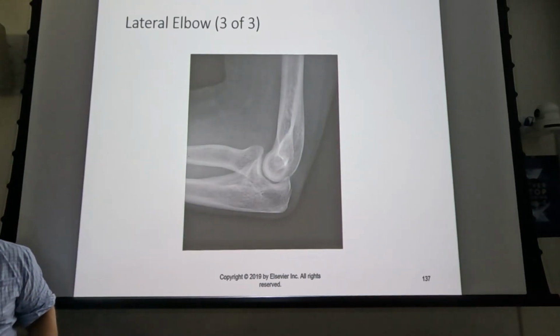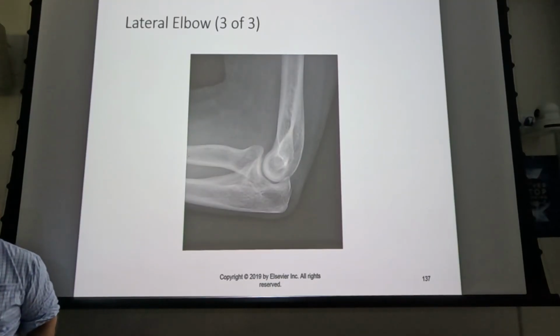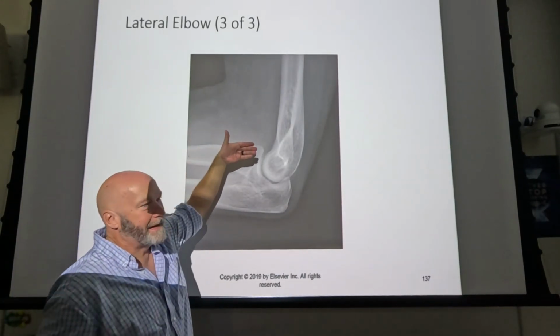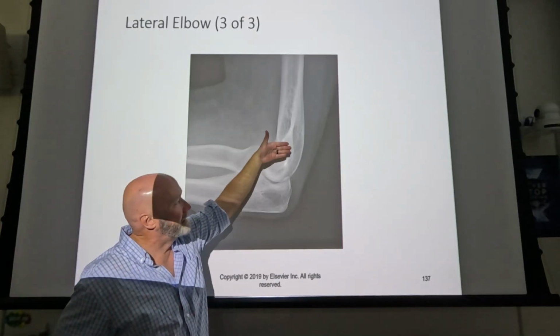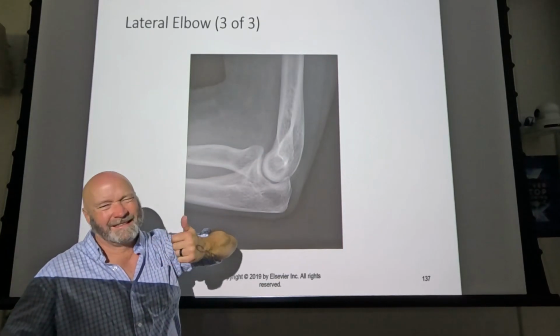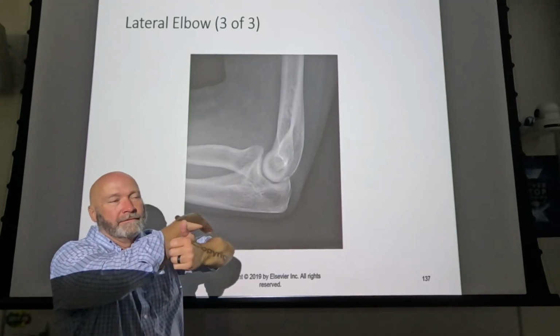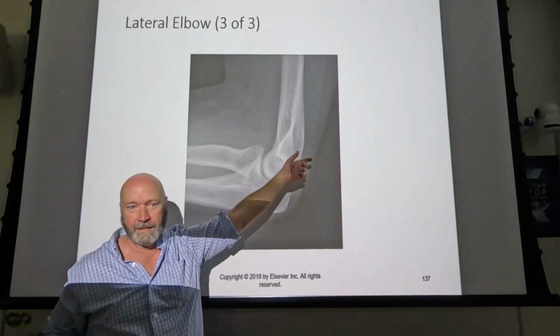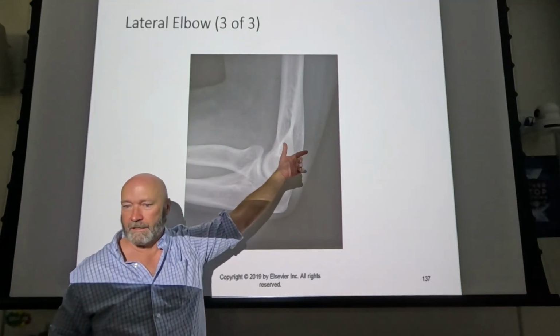The second thing is you can't do a lateral forearm to show a good lateral elbow, because it will project the rotation. I guess that would be the lateral side of the elbow posteriorly, and it'll cover up that fat pad. Just can't do it.